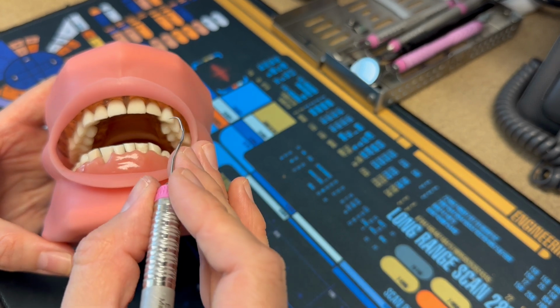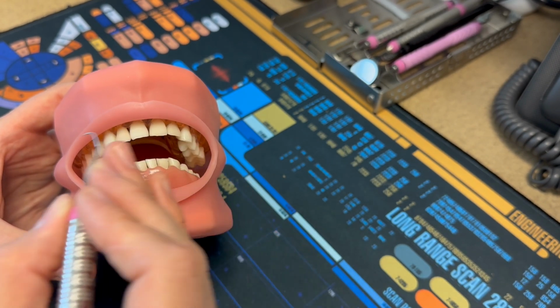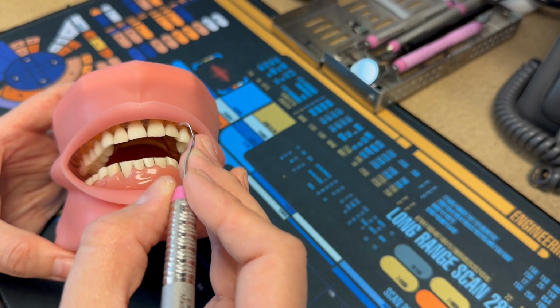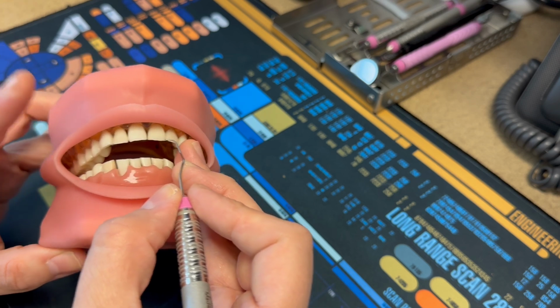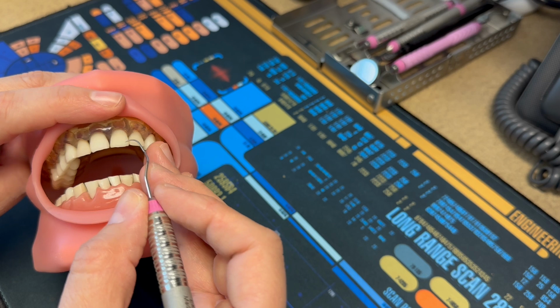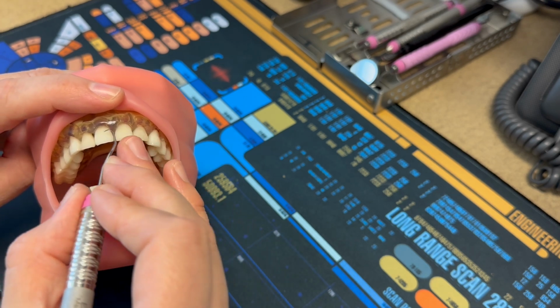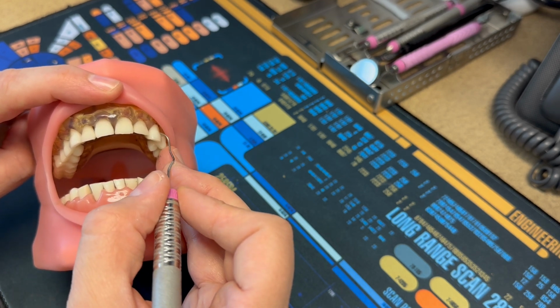So as I approach, your sequence for anterior is going to be furthest away to closest, or if you want to think about it as from your dominant hand to your non-dominant hand, which in this case would be rolling the lip back. And so you can perform your sequence this way. This is for maxillary.